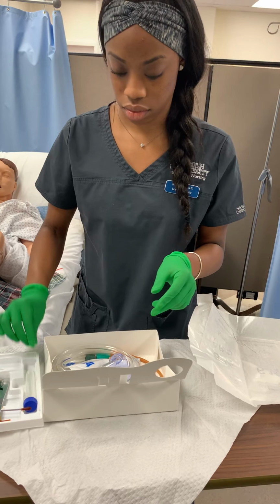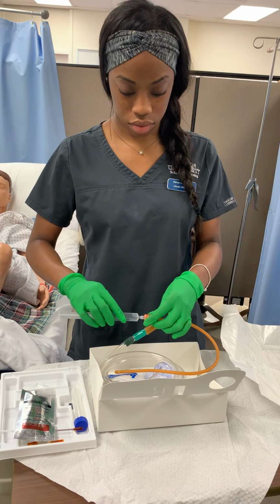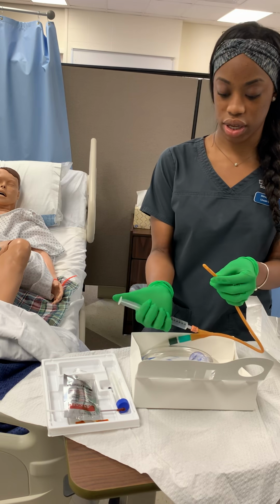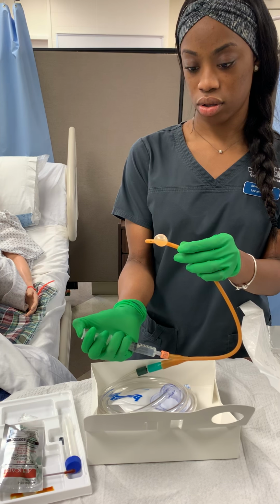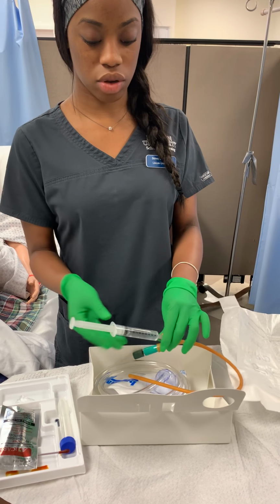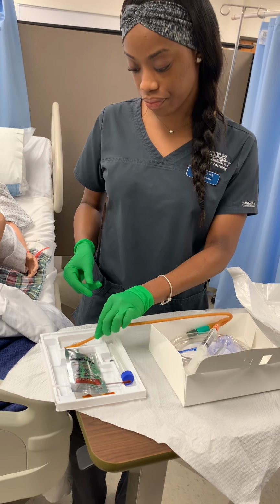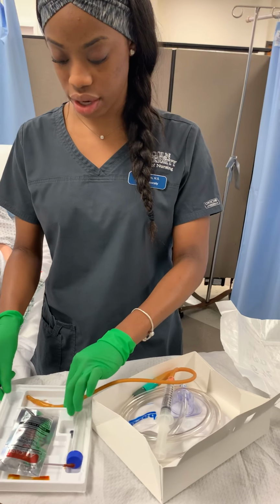Before you do that, you want to test the balloon of the catheter. I will open my syringe stick, which would include 10 cc's. We'll just test the balloon. There we go, the balloon's working fine, and now we would expel that. So now we know the balloon is working fine. I will leave this syringe inside the tube, and now I'm going to lubricate the catheter.